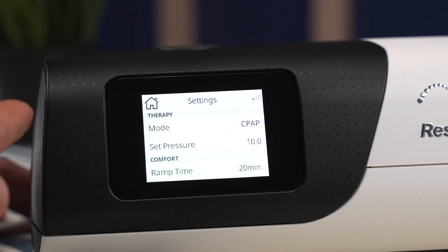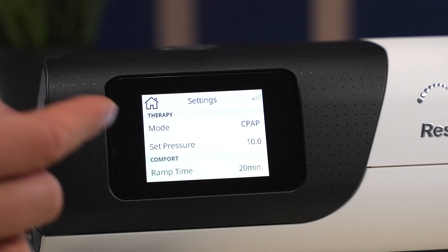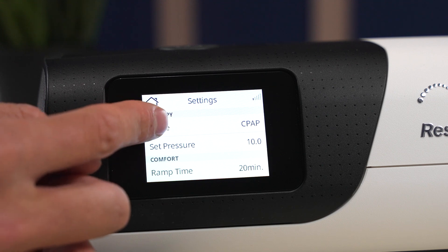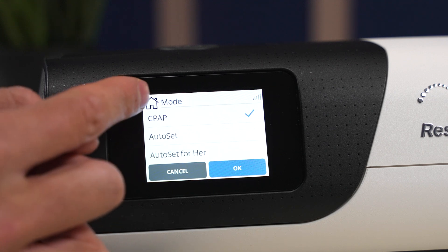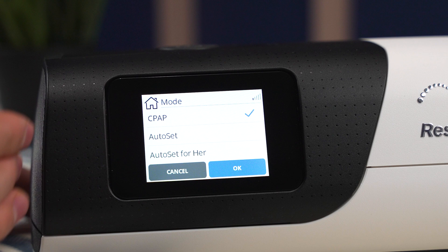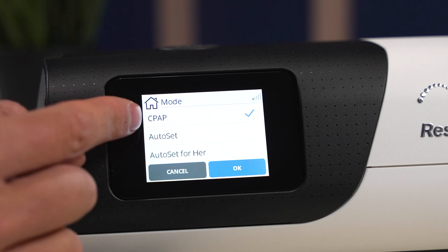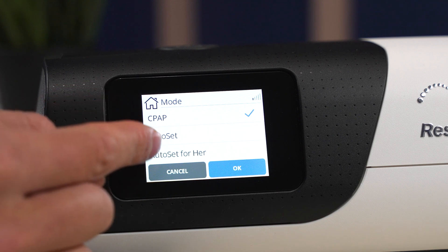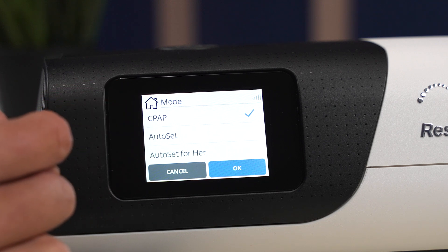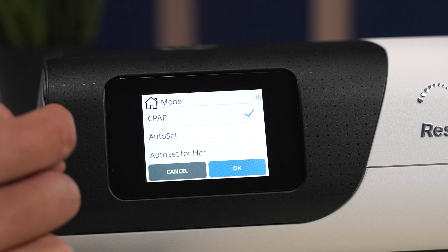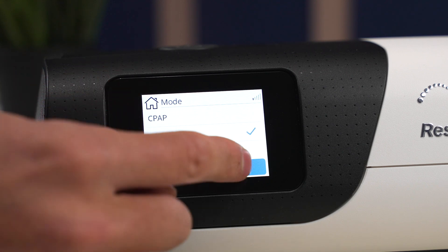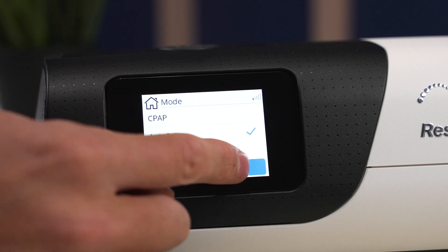At this point we can also change the mode if we like. This also alternates pressure. We have the CPAP mode, which is the continuous pressure I just showed you. Then we have AutoSet and AutoSet for Her — two different algorithms for APAP mode, or automatic pressure mode. We're just going to click AutoSet and click OK.